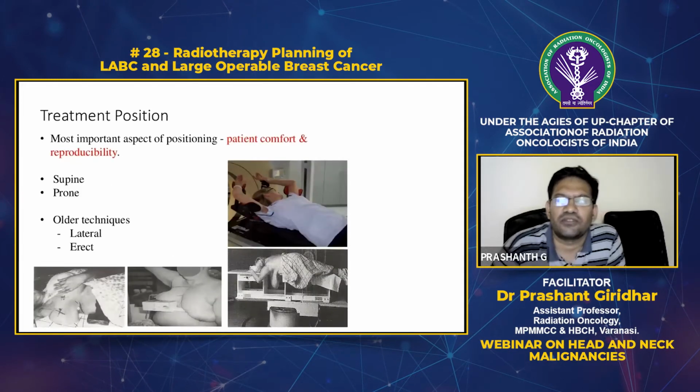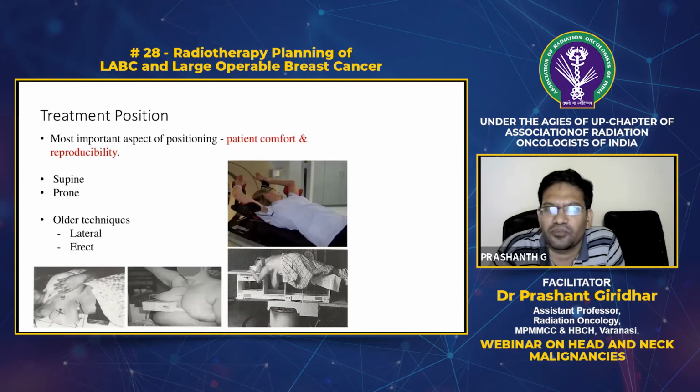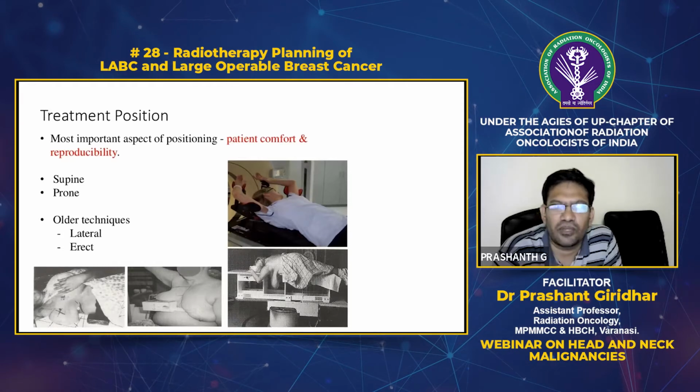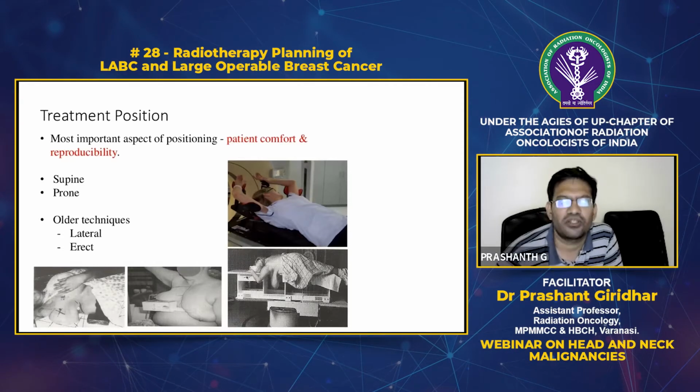So, treatment position. The most important aspect of position is patient comfort and reproducibility. For breast cancer, whole breast radiation and chest wall planning, you have mostly the supine position, but in large breasts, you can also use the prone position.